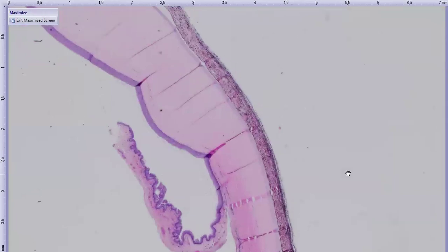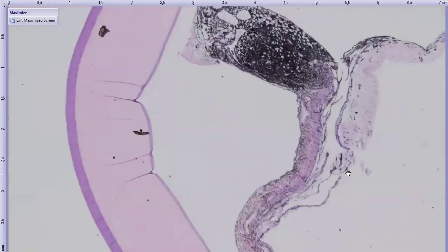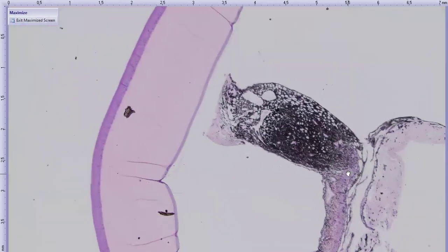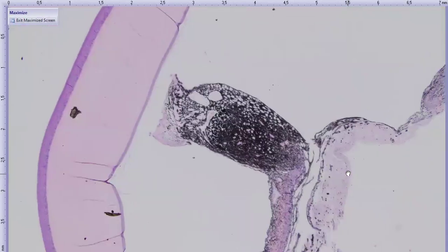So here's the cornea up here, again noting that very narrow anterior chamber. Probably some degree of synechia of the corpora nigra to the posterior cornea, although it's a little bit not obvious in this plane of section in terms of being an actual real synechia.